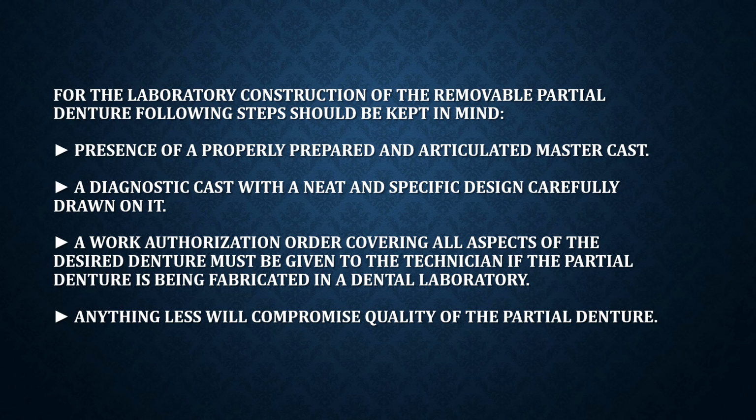Third, a work authorization order covering all aspects of the desired denture, which must be given to the technician if the partial denture is being fabricated by a dental lab. That means all the instructions and the designing have to be carefully written and given, along with all the impressions and casts. If you compromise any of this, the quality of the framework, and obviously of the treatment, will be compromised.